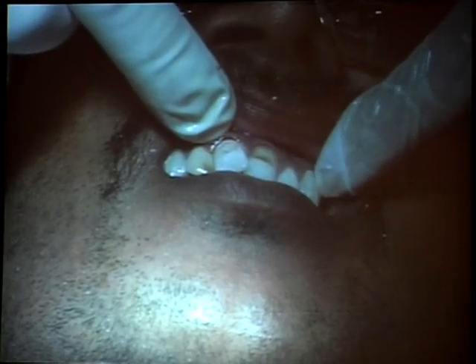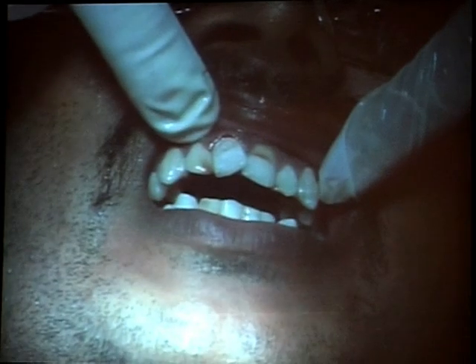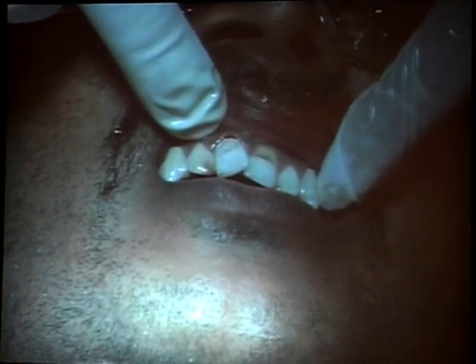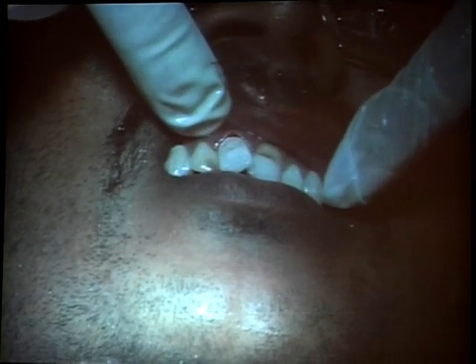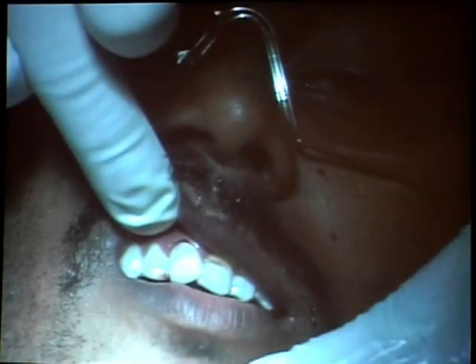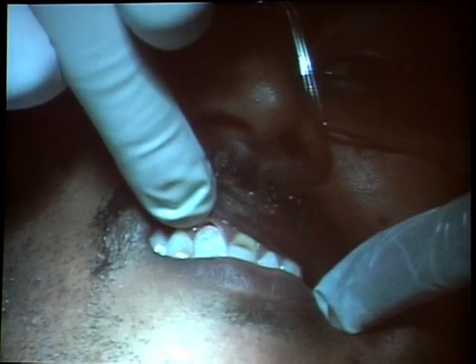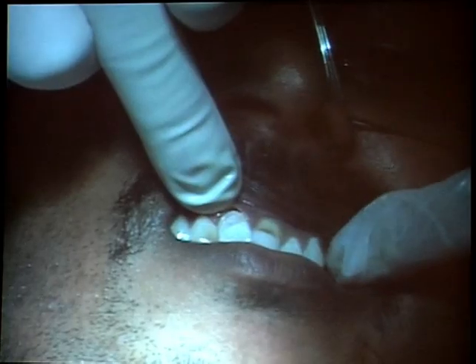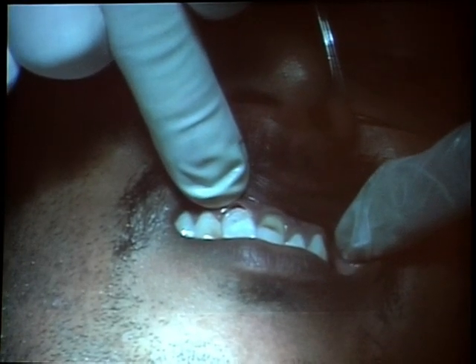Just wait a second. Now see how accurately you can do this. We do laminates like this and you can see the margin that you can make with this. Can you just tone down the camera a little bit downwards? I think they should appreciate the margin that we can make with this. Yeah, it's a little burnt out with the camera. Yeah, can you see the margin now? You can get a margin very accurately, and so it's a very easy way of accurately treating a lesion on the tooth.